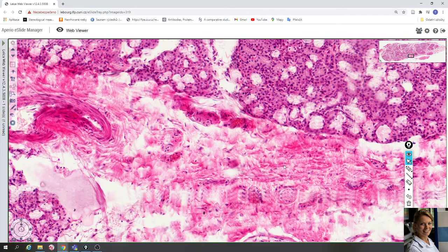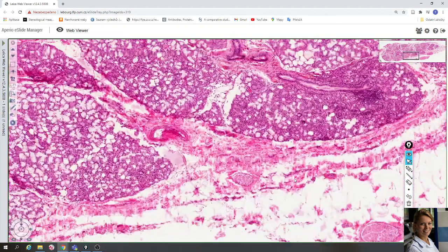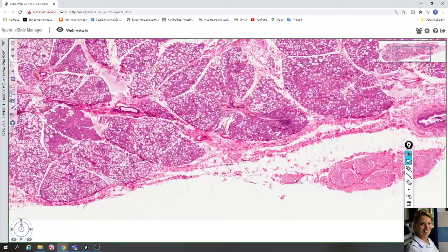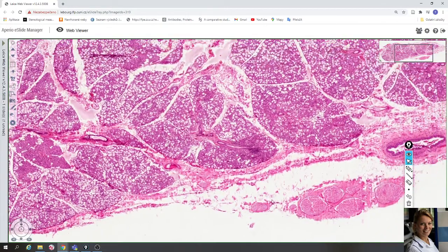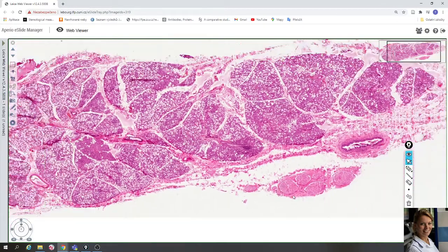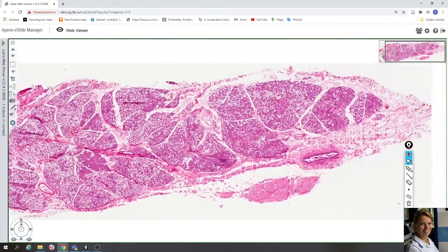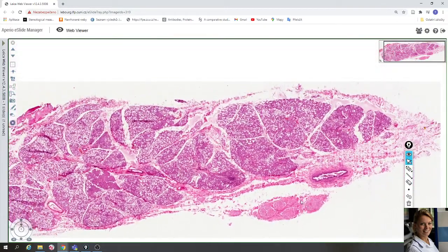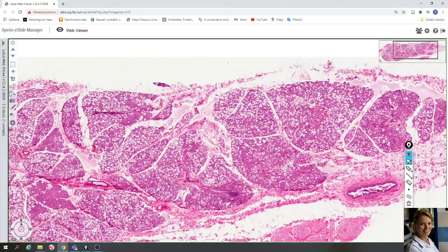You can see pink collagen fibers in the fibrous trabeculae. The sublingual gland is a compound tubuloacinar gland and contains both serous and mucous acini.